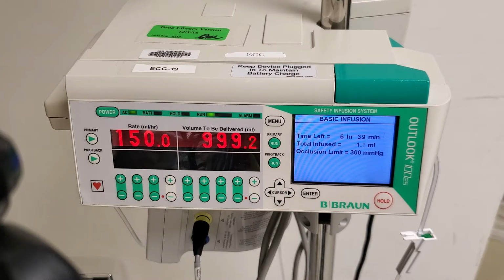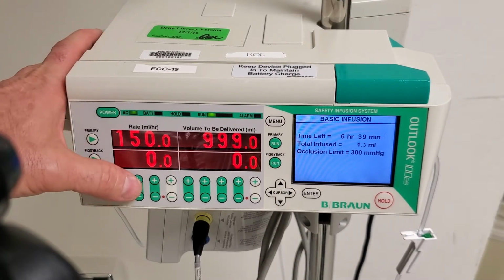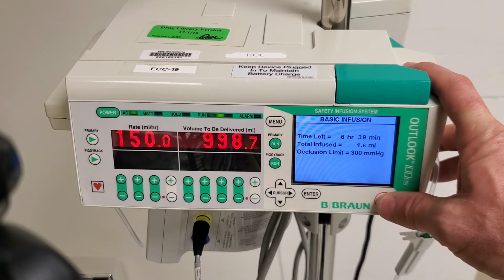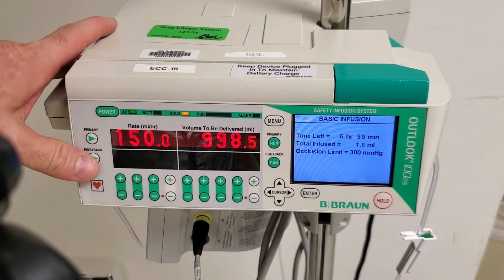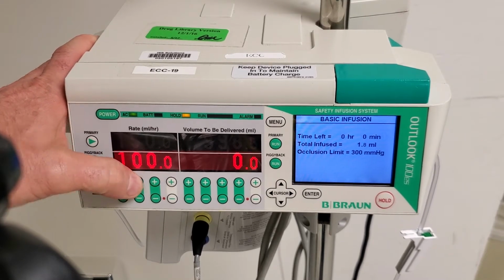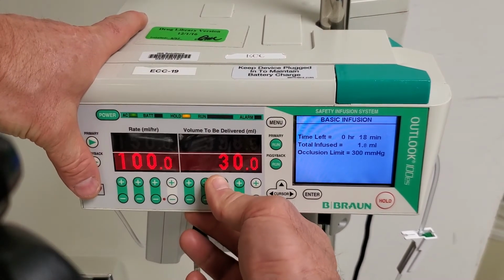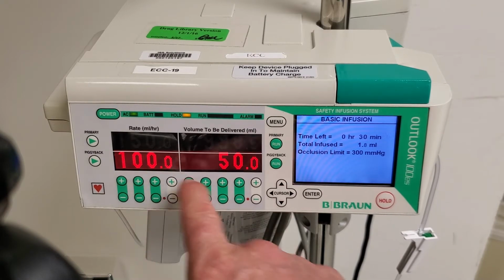So the way we're going to do that is select our piggyback channel. Now we have the option of entering in data. Remember that you have to stop the infusion to program a piggyback. So we press hold, we stop the infusion, we enter in, we're doing 50 mLs over half an hour. So that's 50 mLs to be delivered at 100 mLs an hour.